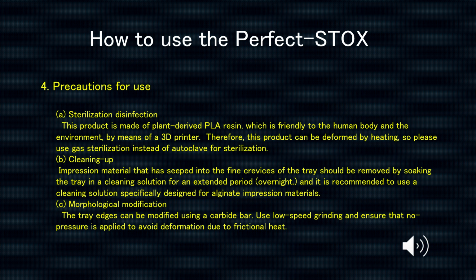B. Cleaning up. Impression material that has seeped into the fine crevices of the tray should be removed by soaking the tray in a cleaning solution for an extended period, overnight. And it is recommended to use a cleaning solution specifically designed for alginate impression materials.